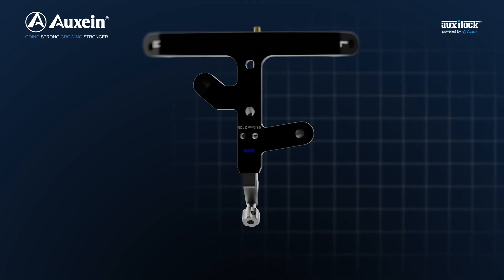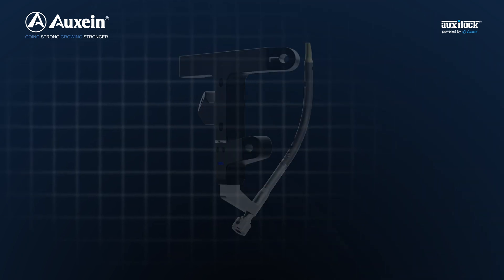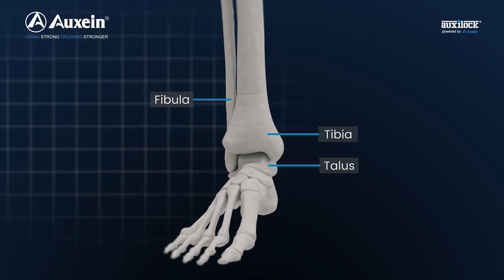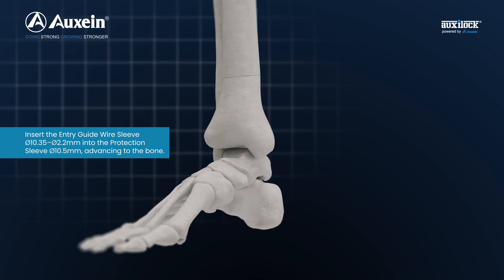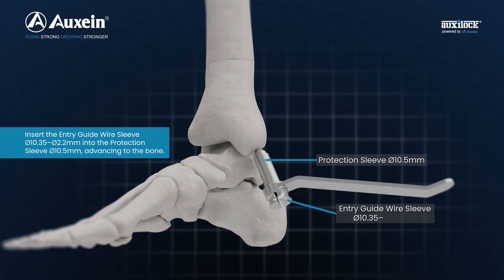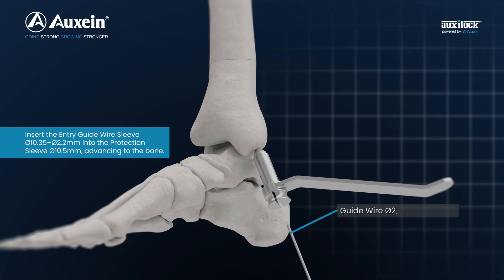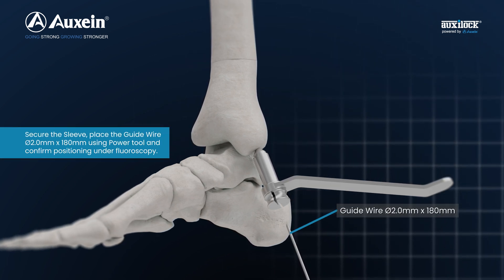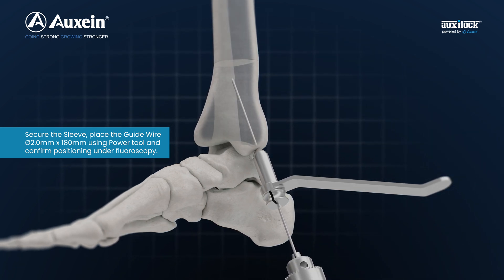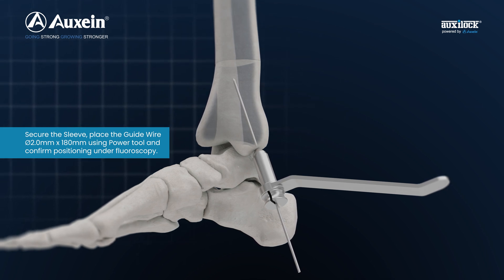Mark and make the entry point at medial malleolus with guide wire and confirm under fluoroscopy. Insert the entry guide wire sleeve diameter 10.35 to 2.2 mm into the protection sleeve 10.5 mm, advancing to the bone. Secure the sleeve and place the guide wire diameter 2.0 mm x 180 mm using power tool and confirm positioning under fluoroscopy.